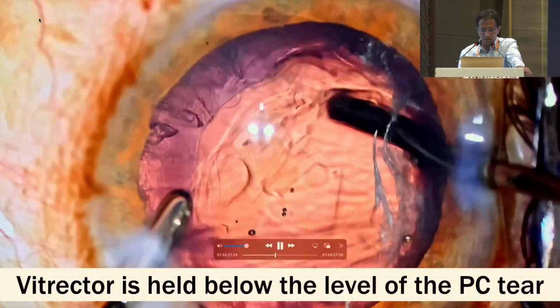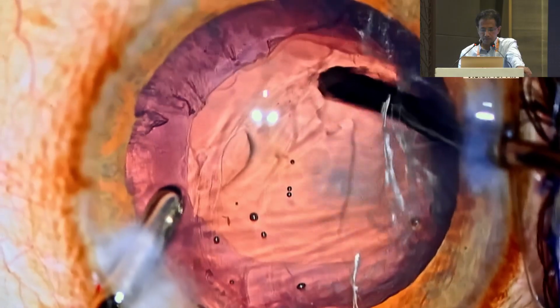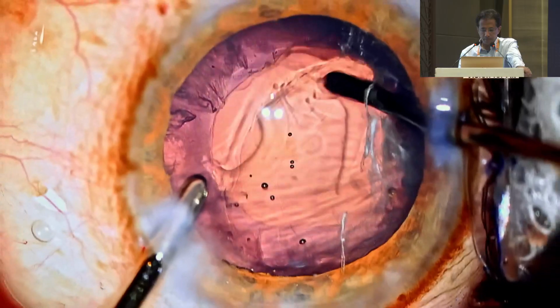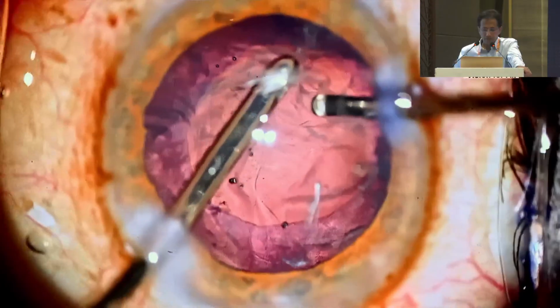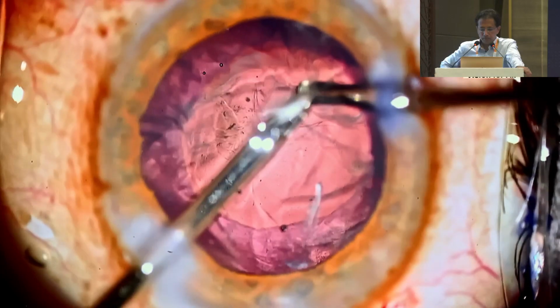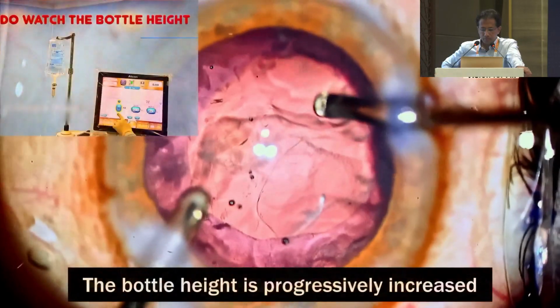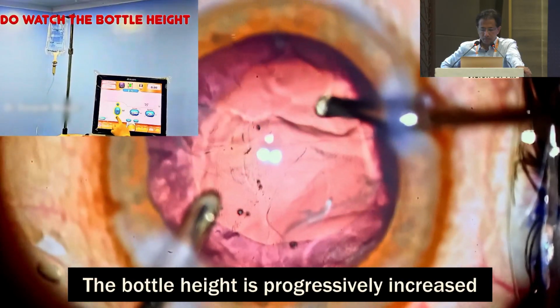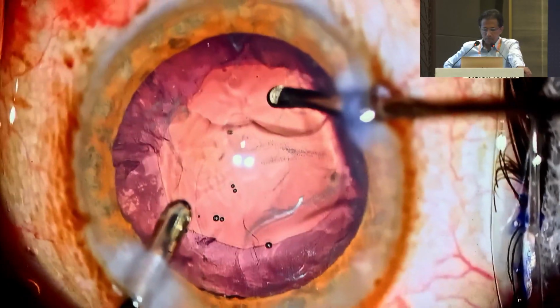The vitrector is positioned just below the level of the posterior capsule tear, and with the port facing sideways first, followed by posteriorly, the vitreous is segmented from the anteriorly prolapsed vitreous. Then the port is turned anteriorly and the prolapsed vitreous is taken care of. The bottle height is progressively increased as the chamber is emptied of the OVD and the vitreous, so that the chamber equilibrium is not compromised.